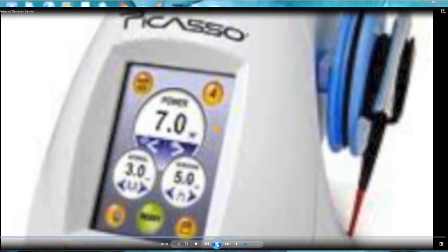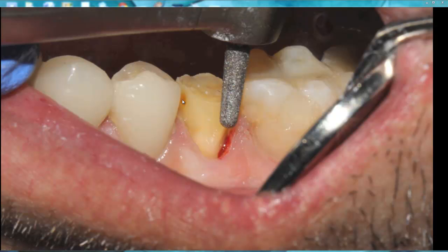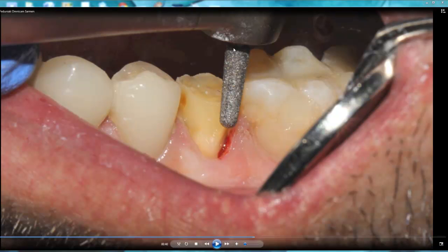So the next step again, we're going to use bur case 6. It's a fine diamond bur. I'll go around the tooth structure to make sure it removes all the irregularity during my preparation. It smooths the margins, but you can see that the bur is very big. Sometimes it's very difficult to get into proximal areas, and at that time I've been using KS0 fine to go into proximal and polish my margins.